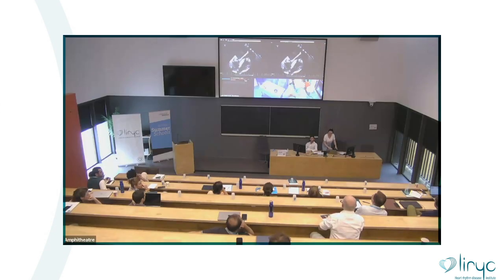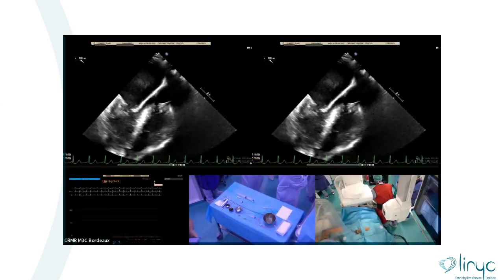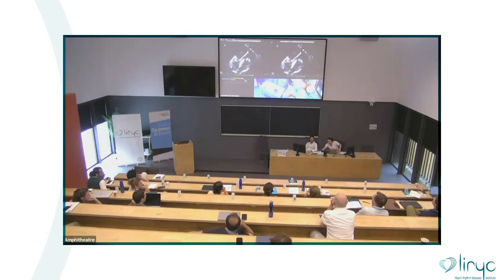Can I make a comment? It's Mark here. Hey, Mark. Yeah. Sure. I think you underestimate here the distance to the aortic valve. Here you would say, so in the long axis, it's only 3 millimeters. However, can you go back to the short axis? There you will see that actually the VSD is just below the commissure, right?